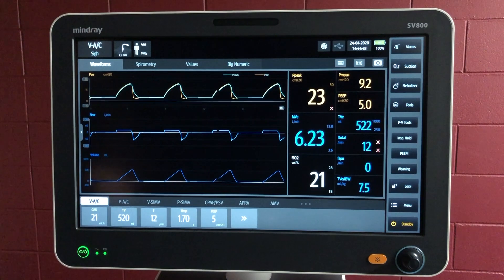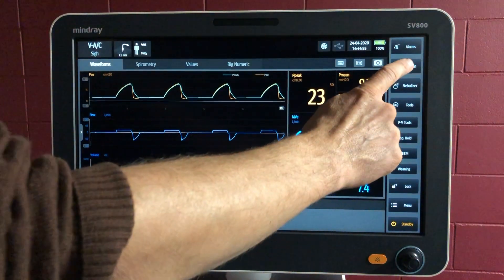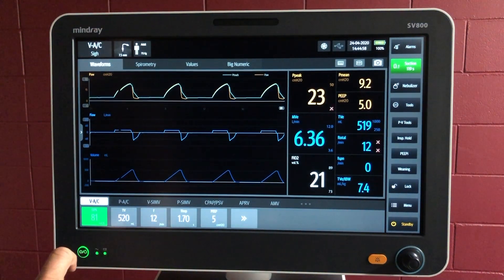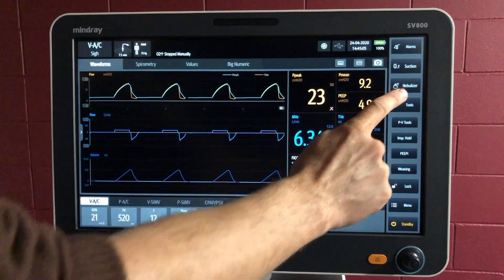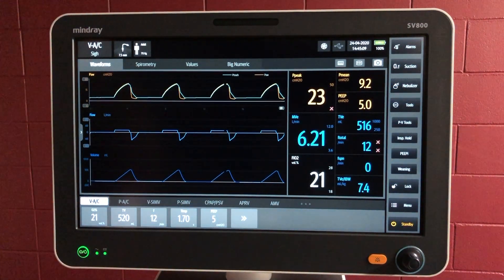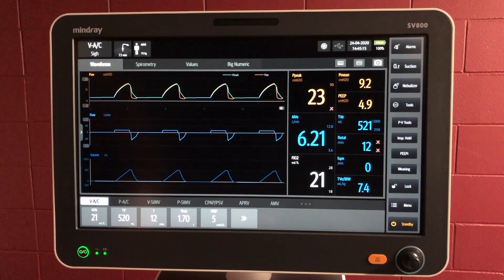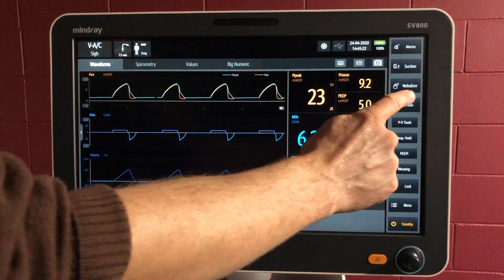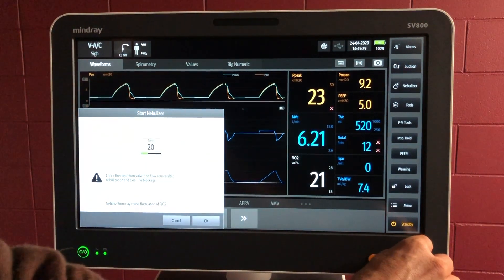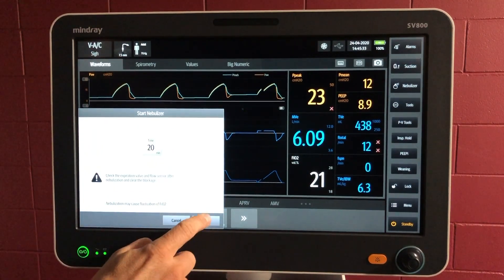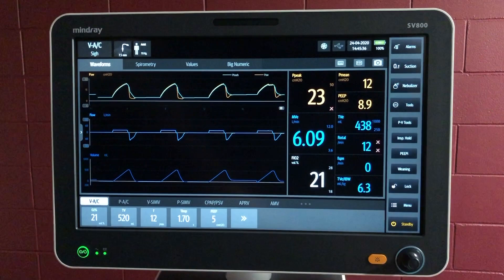O2 suction — this increases the oxygen when you're suctioning, so you're pre-empting a desaturation for suctioning. Pushing that there will give you a countdown clock as well for how long it's going for. The nebulizer — you can either use an ultrasonic or a gas-supplied one from the ventilator. Between the inlet valve and the expiratory valve there's the intake for the tubing for the nebulizer, and that is how you activate it. You can choose how long it goes for — we'll choose 20 minutes — and it will start.